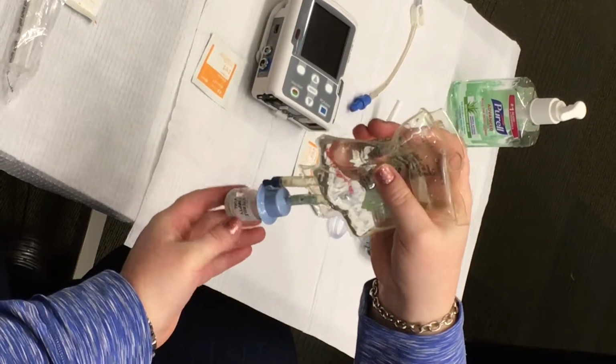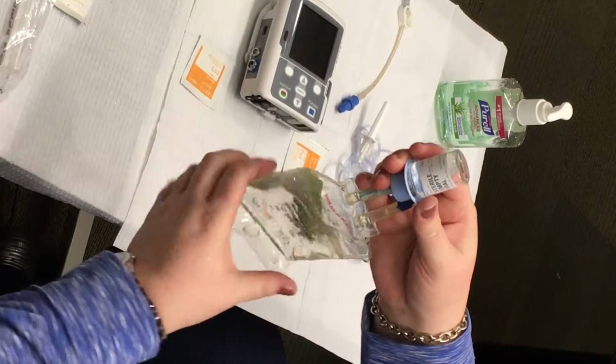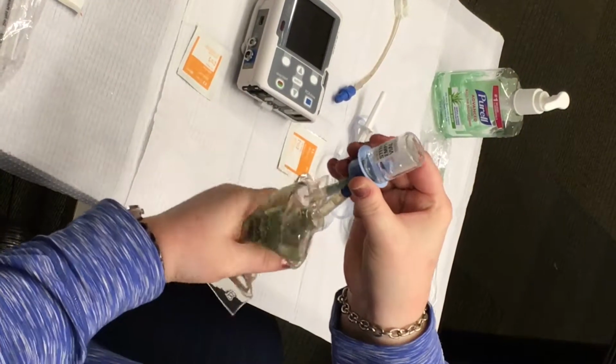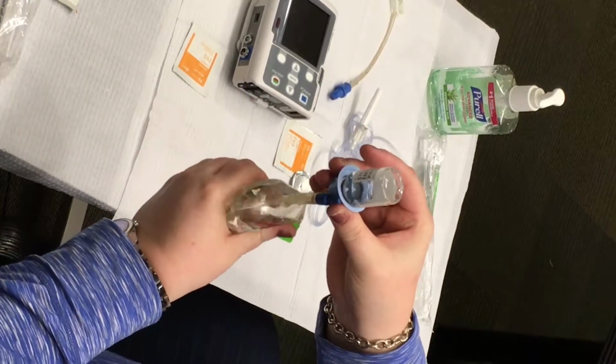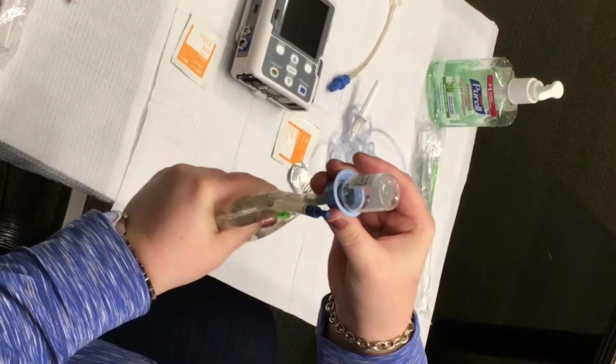Now hold the bag upside down with the vial on top. Squeeze the bag to force air into the vial. Alternately squeeze and let go of the bag so the medication drains back into the bag. Make sure the drug is fully dissolved. Do not remove the drug vial.